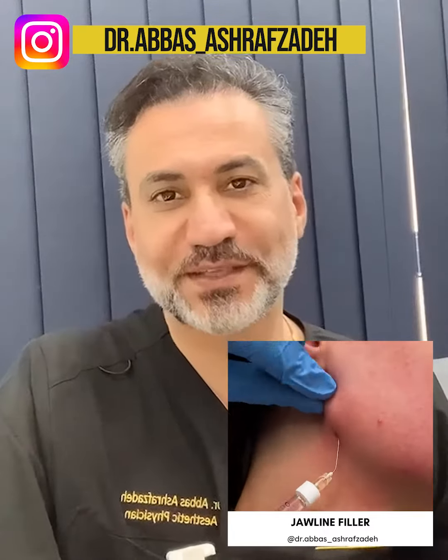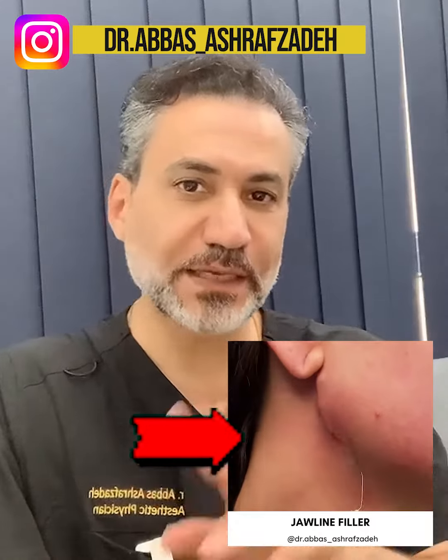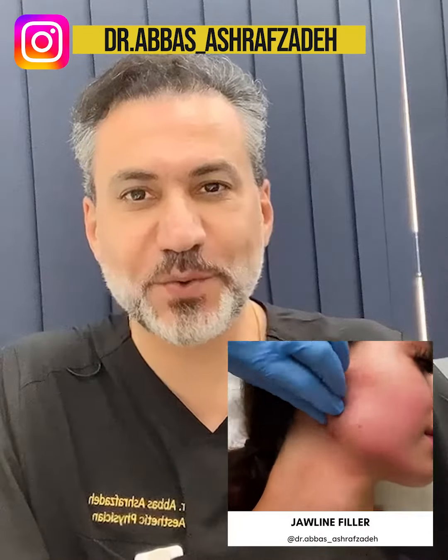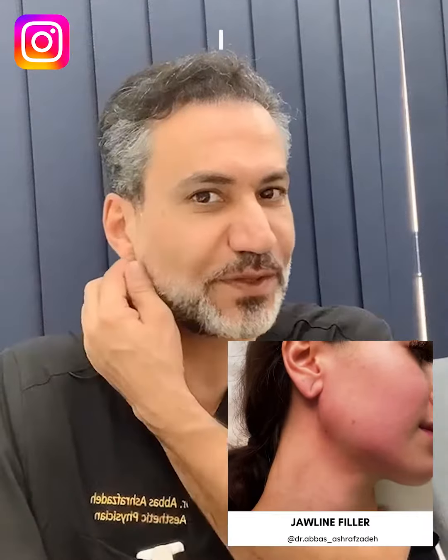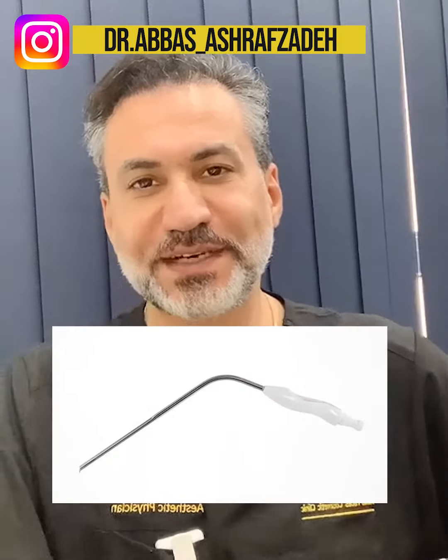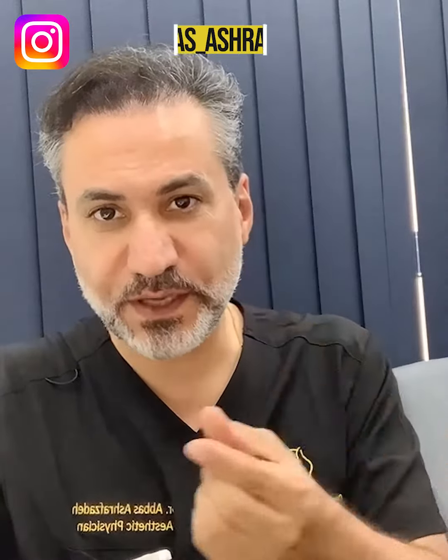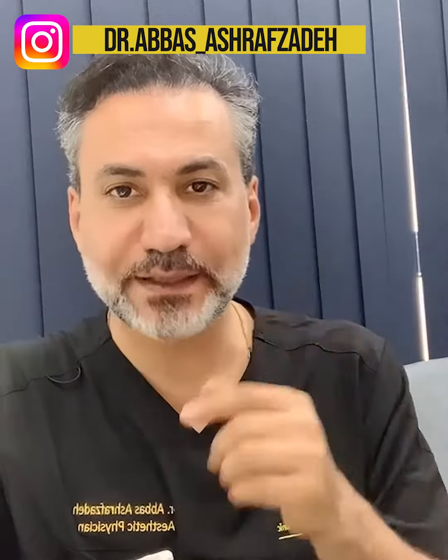For jawline filler injection, I have so many techniques, but in previous posts I did, it was about the jawline angle here. I used a curved cannula to inject the filler and make a nice jaw angle. In this technique, using the cannula and injecting subcutaneously, there is no danger for injecting the filler in that area, and it will create a very nice L-shape jaw angle.